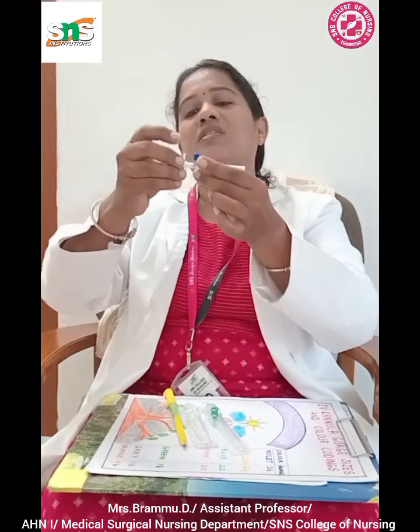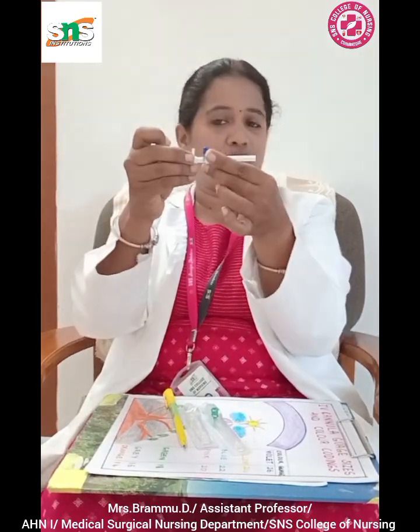So actually the flashback chamber is guiding the nurse that we have entered the line, and this valve is acting like a chamber, allowing only the fluids to enter the vein rather than the blood backflowing again, even after connecting to the IV line, or medications or your blood products. So this is acting as a great main mechanism, that is the valve.